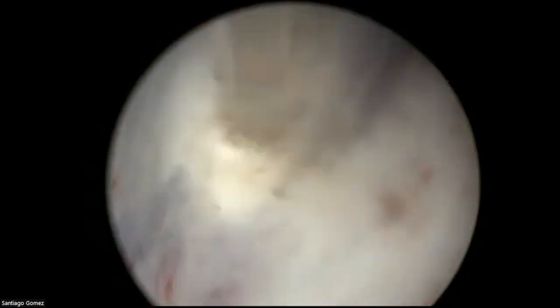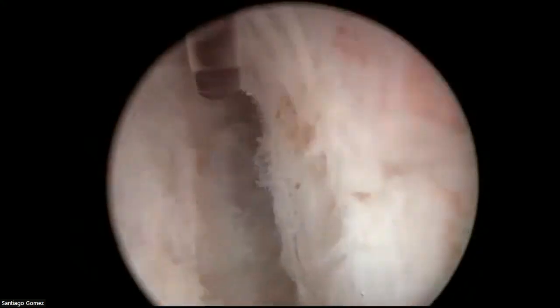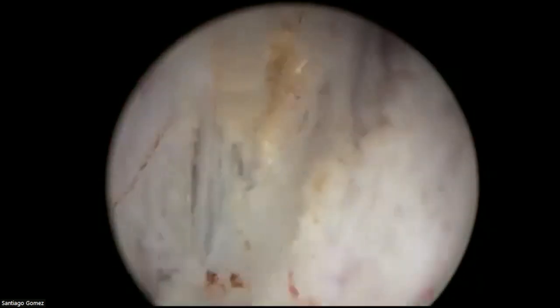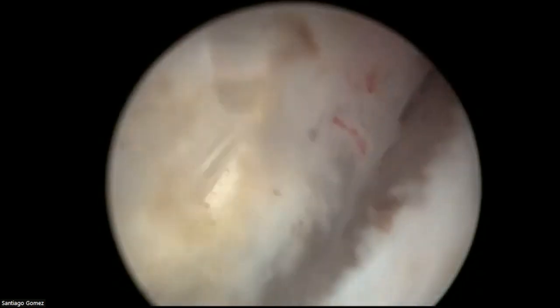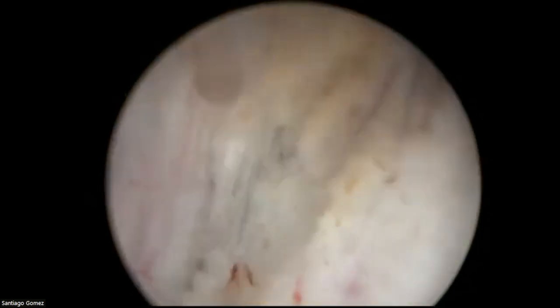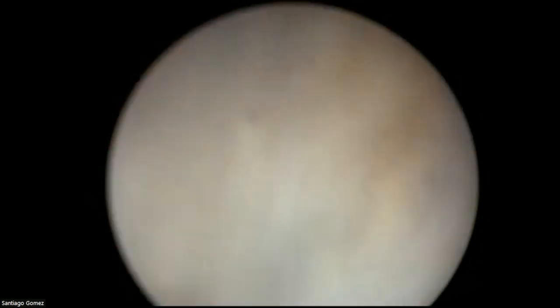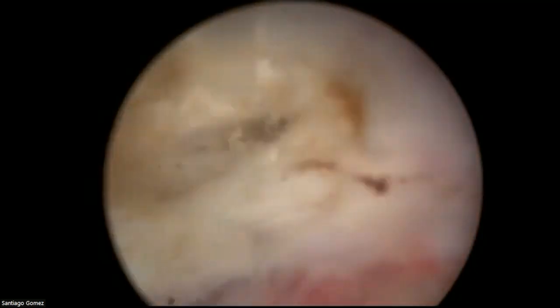Okay, and that was the problem with the original technique. People would get under the adenoma and come up all the way without looking back, without looking at the sphincter, and that would damage the sphincter. And that would cause stress incontinence postoperatively, because the classic HoLEP technique was very careless about what is going on at the apex as you dissect the plane.